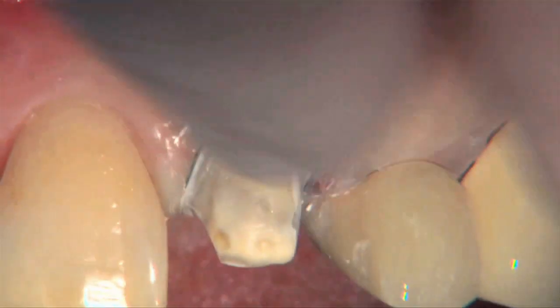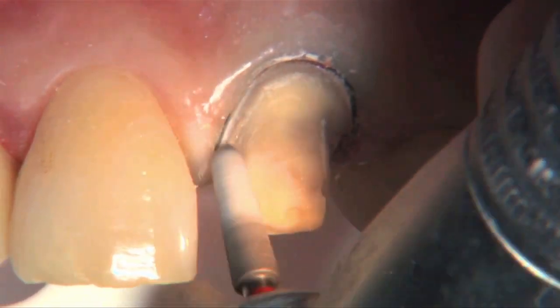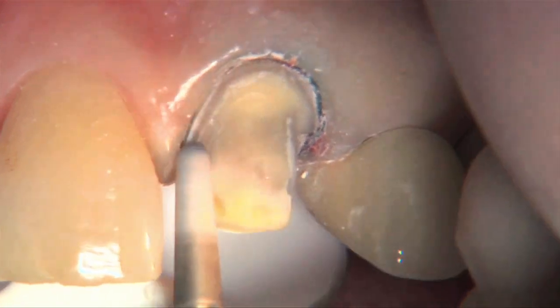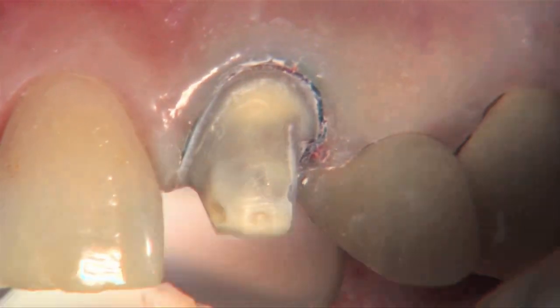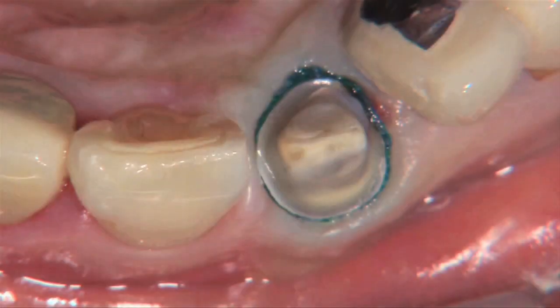So again, turning the RPMs on the electric handpiece down to 2000 RPMs, turning off the water, and you have to be even more careful with this fine grit burr, because it doesn't remove a lot of tooth structure, it actually creates more frictional heat on the surface of the tooth. So with the water off and the handpiece turned down, there's actually more chance of heating up the tooth with the fine grit burr than the super coarse grit burr.